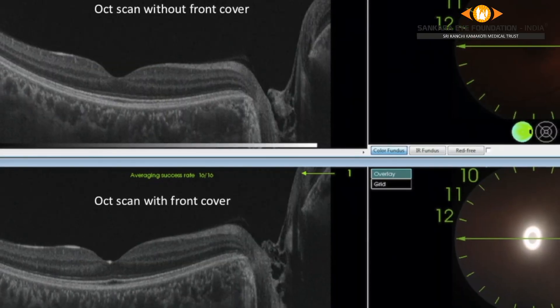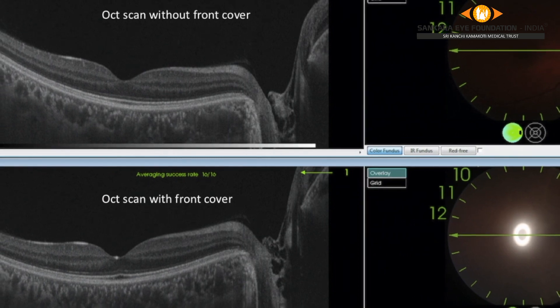Here is a picture showing a comparison of the OCT scan quality before and after putting the front cover.